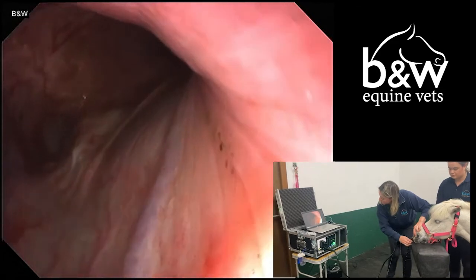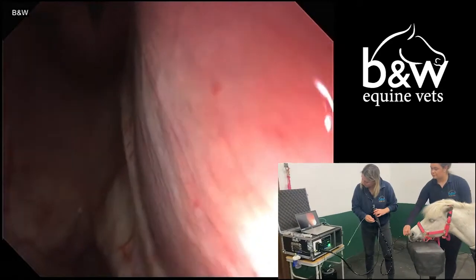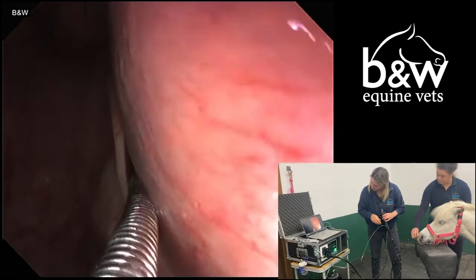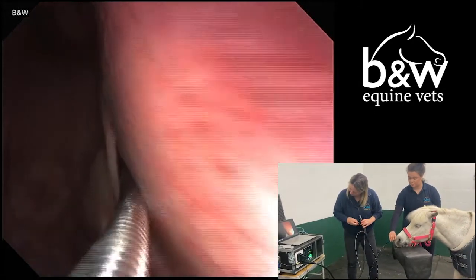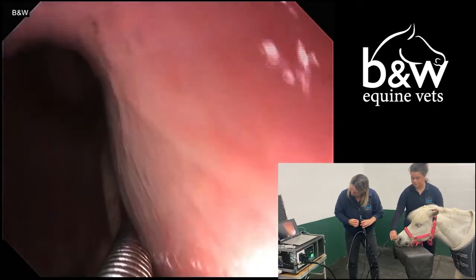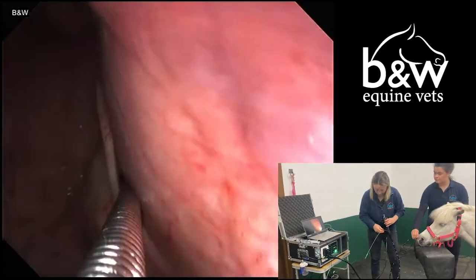The first phase is to pass the endoscope up the nasal passage on one side of the horse's nostril. Once we're at the back of the throat, we look for the small flap which is the entrance to the guttural pouch, which is called the ostia. The ostia is placed quite tightly against the side of the inside of the horse's throat.